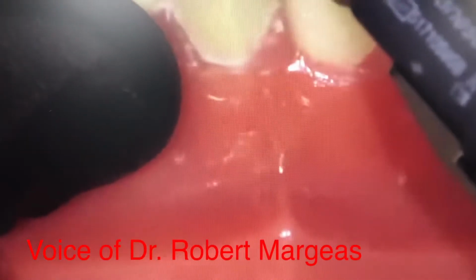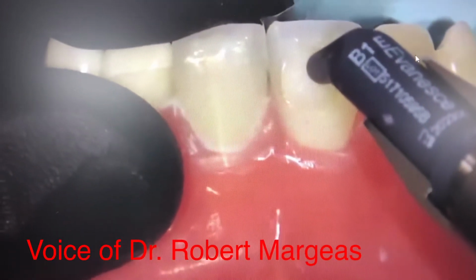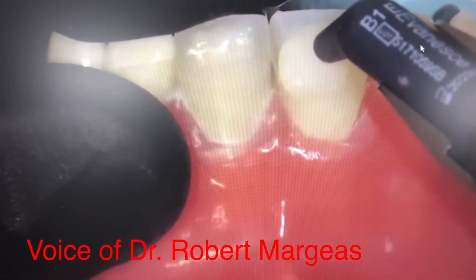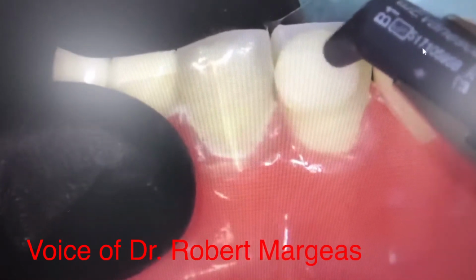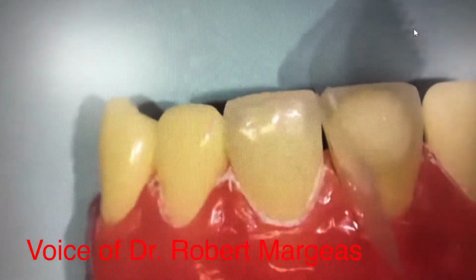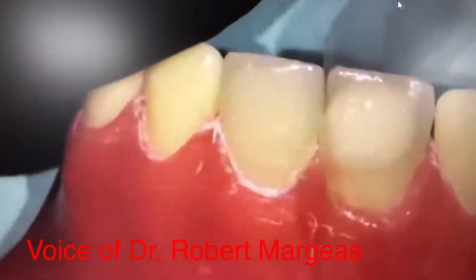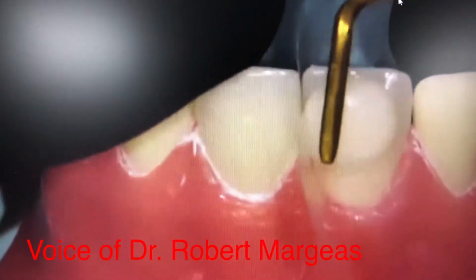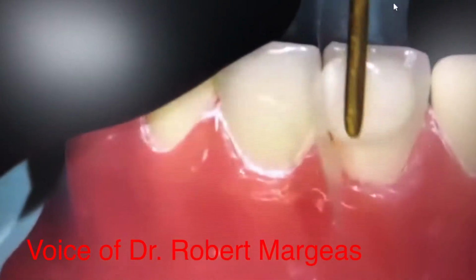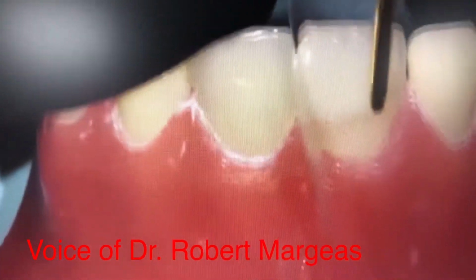So I'm going to take that B1 and I'm going to start with more material than I need. And I'm basically pushing this out and I'm allowing it to express itself like that. And you can see how much material I placed. Now, I want to start with more material than I need, because I don't want to have to keep on adding material, because if you add material and you fold it on itself, it can be a problem, okay? So what I'm going to do is take the material, work it down to the incisal edge, making sure I've covered my margins.